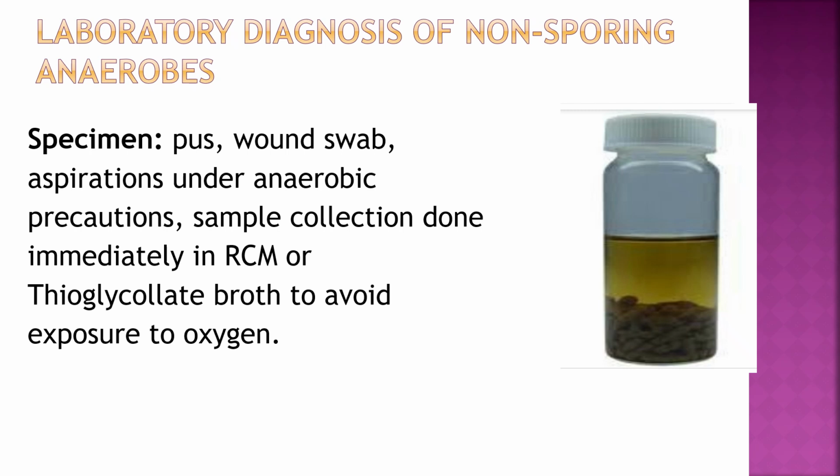Now we'll see lab diagnosis of non-sporing anaerobes. The specimen is pus, wound swab, or aspirations under anaerobic precautions. Sample collection is done immediately in Robertson cooked meat media or thioglycolate broth to avoid exposure to oxygen.